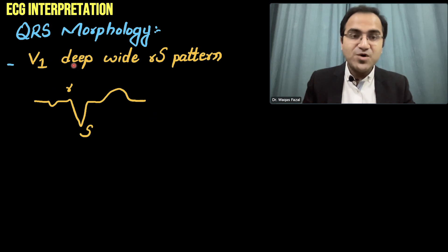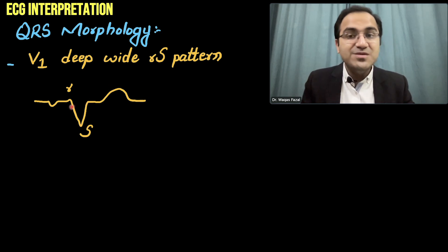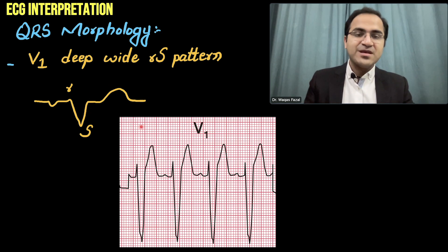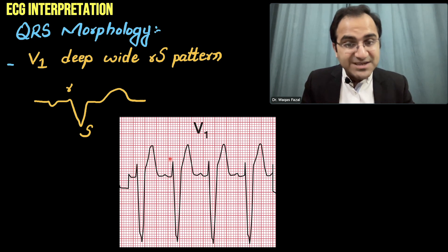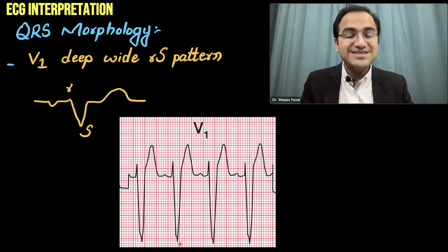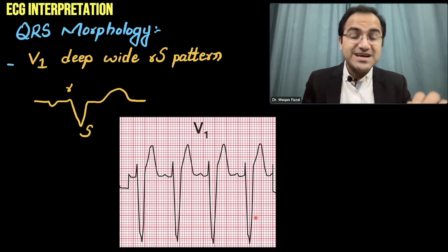Coming to the QRS morphology in lead V1: in V1 you will see a deep wide RS pattern. The S wave will be deep, and there will be slurring of the S wave. The first deflection is the R wave and after that is the S wave. Look at the deep, slurred S wave seen in V1.